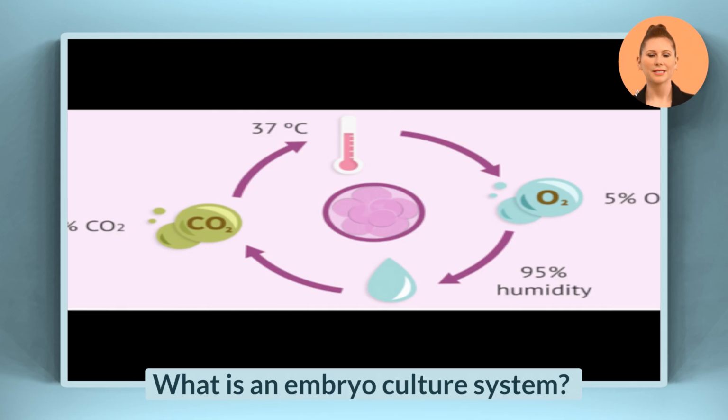An embryo culture system is the specific combination of environmental conditions, technical equipment, and particular nutrients that embryos require for optimal growth. Perhaps the most important factor is the embryologist's ability to maintain a stable environment within a laboratory. In order to optimize this environment, we must tightly control all conditions affecting the embryo, including light, temperature, humidity, and the concentration of gases that each embryo is incubated with.